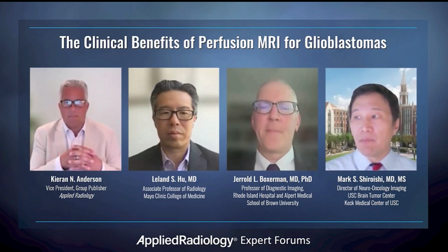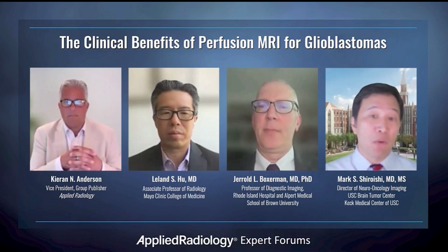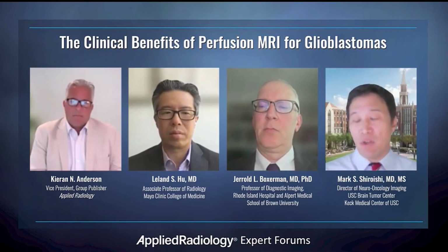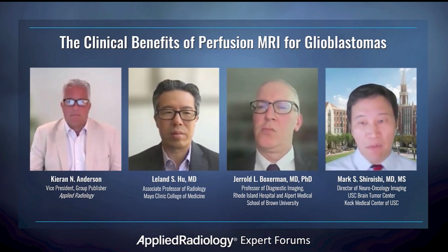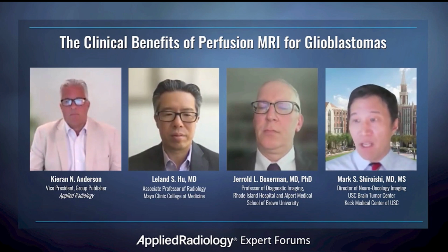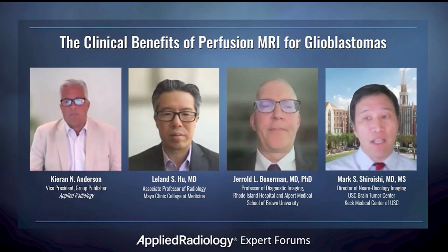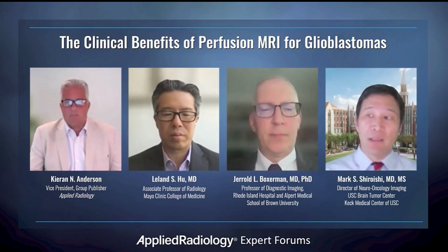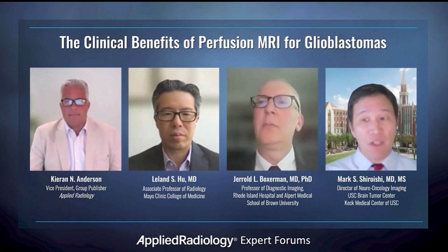And then from an implementation standpoint, ensuring that your referring clinicians understand the uses and the way to interpret perfusion MRI, and maybe having a grand rounds or something and talking to the clinicians, the oncologists, the radiation oncologists, surgeons, and making them understand what perfusion can potentially give them, I think would be a really great way to start. And also understanding your software and making sure that you have adequate technical support or have someone to ask, because each software can be quite idiosyncratic, and understanding the bugs or how to troubleshoot when you have issues with that, I think would be really helpful.